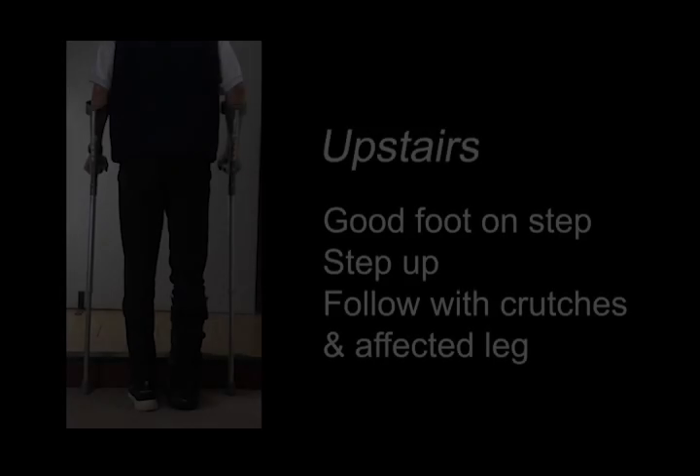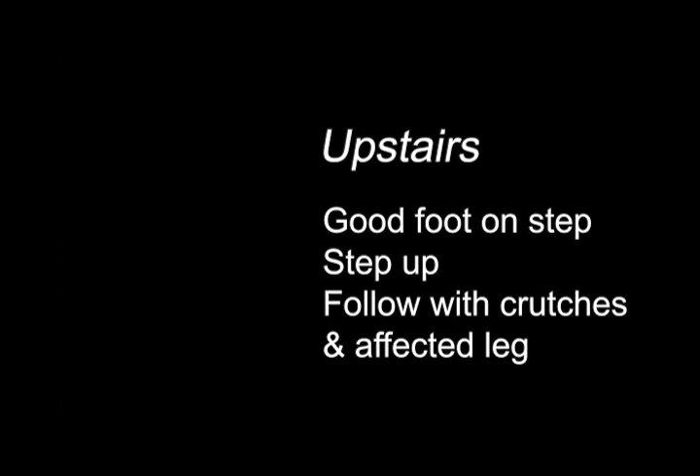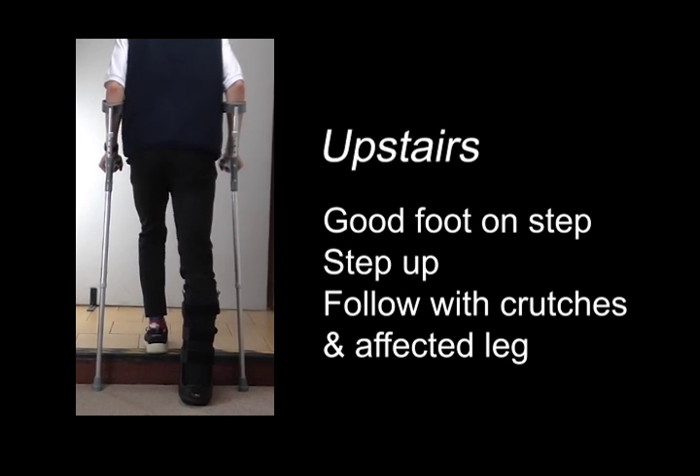When you go upstairs, you put your good foot — that is your unaffected leg — on the step and then follow with the crutches and your affected leg.